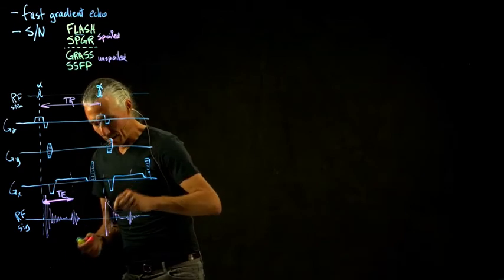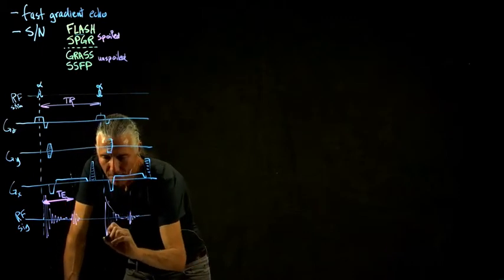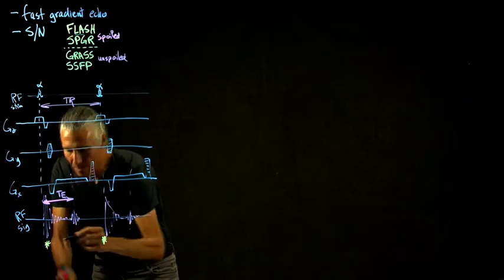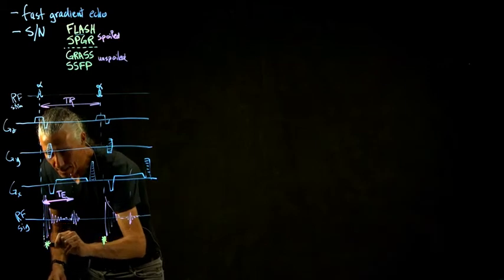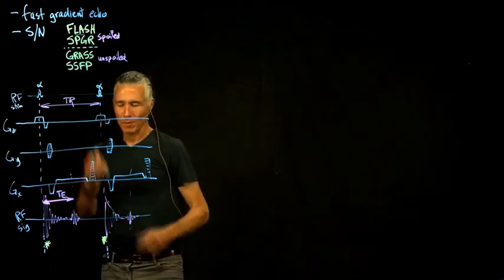We're going to look particularly at this time point right here, just right before, and this time point here, just right after. So I'll highlight those in advance. Those are 2 time points that we're looking at in our equations to try to figure out what the brightness is.